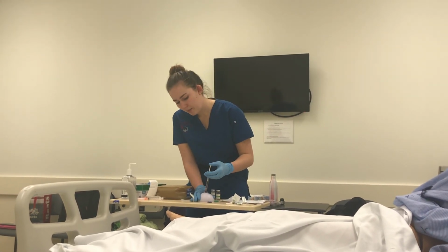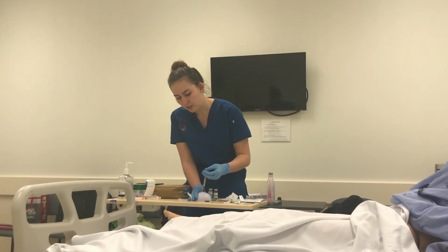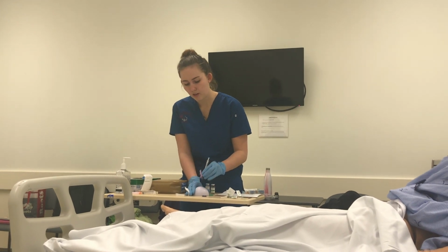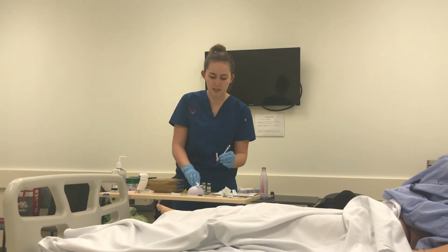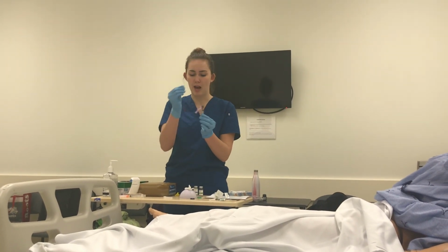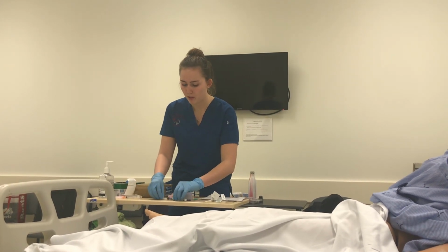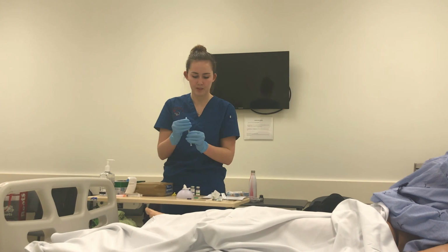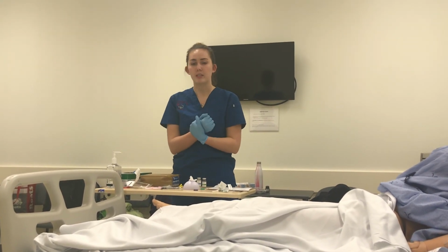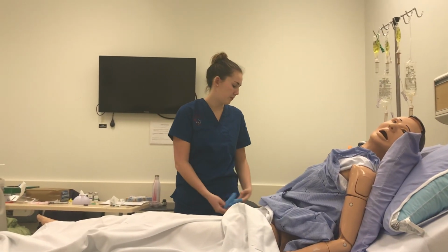So now I'm going to administer the medication and hold it there for 5 seconds. And remove it, replace it with gauze. So for the purpose of this assessment, I'm not going to recap it using the safety. I'm going to, like so. And then with these needles, I would dispose of them in the sharps container. Okay, so now we are done the assessment. I will remove my gloves and replace them in the garbage.